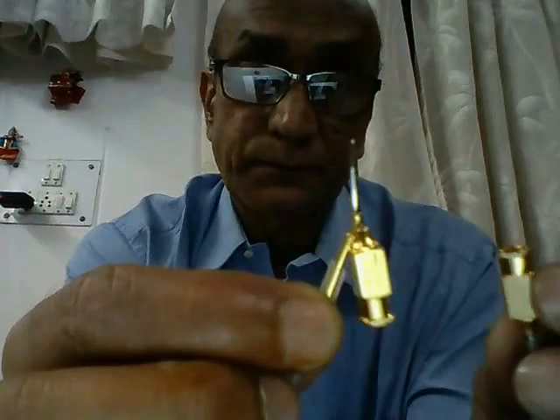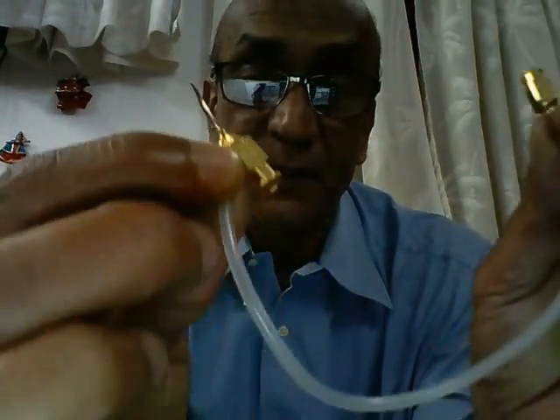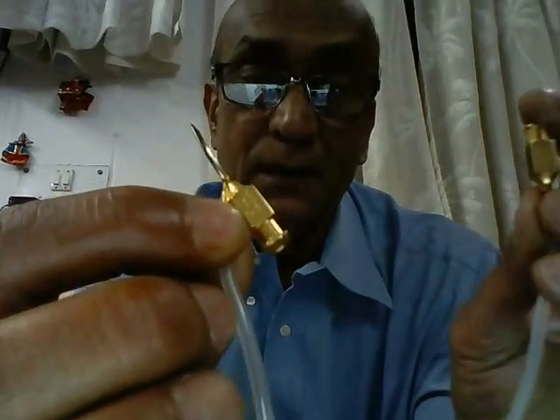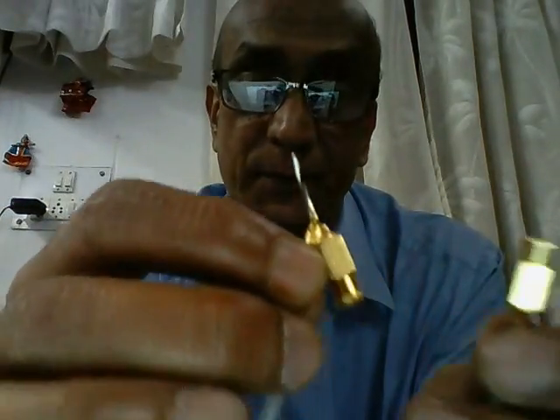This metallic hub that you see is a luer hub. In a direct Simcoe, this hub is meant for irrigation — once we inject fluid through this hub, it comes out through the side port and fills up the anterior chamber. In the same direct Simcoe, the hub which is attached to the PVC pipe is the aspiration hub. We aspirate through this, and therefore the fluid goes through the tip and comes out from here.